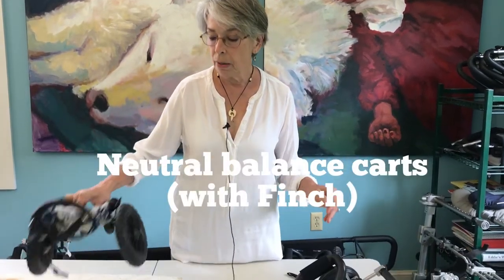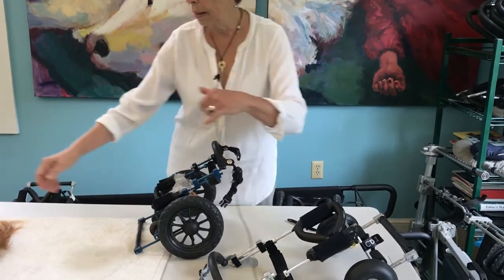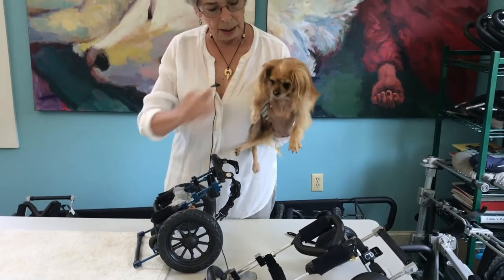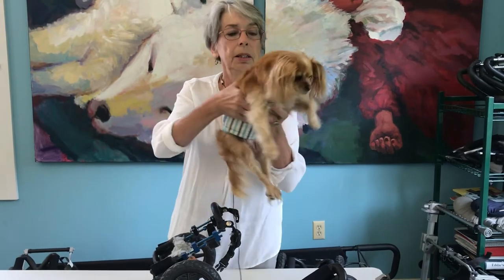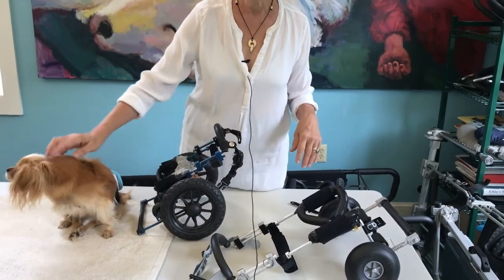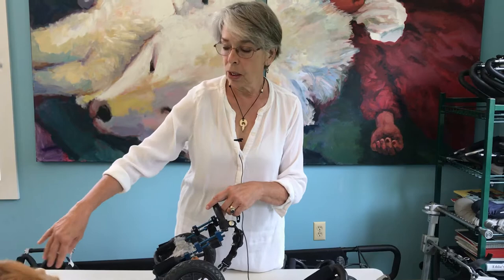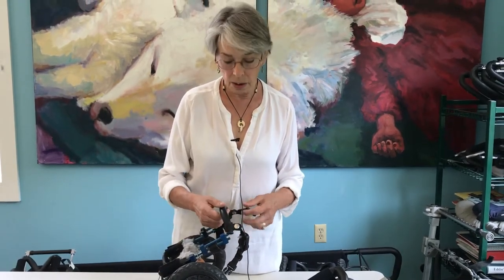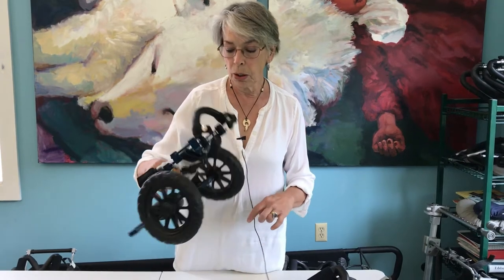Eddie's Wheels is unique in the world for balancing carts. This is Finch's cart, and this is Finch — my chihuahua. He's two years old. He came here a year ago weighing four pounds; now we have him up to more than six pounds. He had a broken back — we don't know how that happened. He's deep pain negative but he does have reflexes. When we got him at four pounds his elbows were luxating and he was very skinny, his adult coat hadn't grown in yet, and we wanted to make him a cart that would be weightless on his shoulders. So we engineered what we call a neutral balance cart.